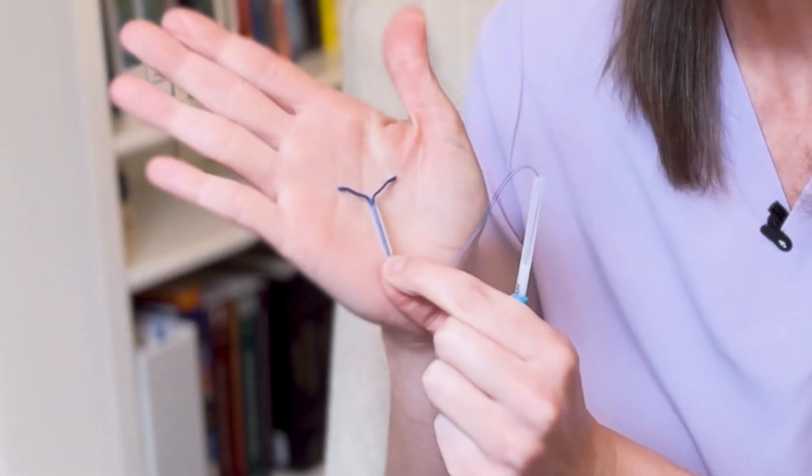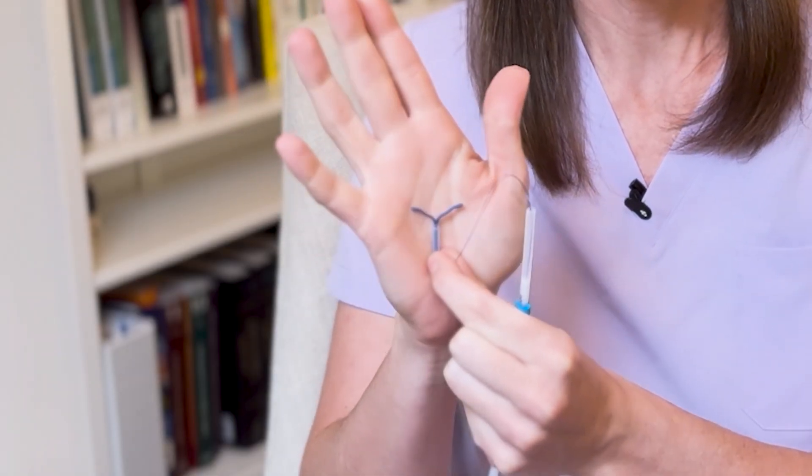The Mirena has 52 milligrams of levonorgestrel, and it secretes that hormone at 20 micrograms a day. This is the approximate size of the Mirena IUD as you can see it up against my hand. This is the body where the hormone is kept, and these are the arms. There's no hormone in the arms of this IUD.